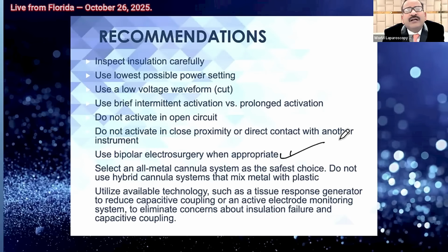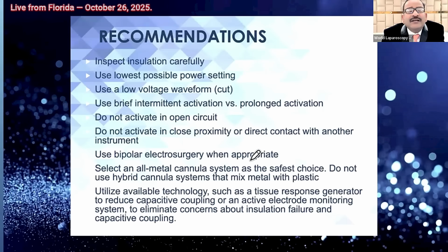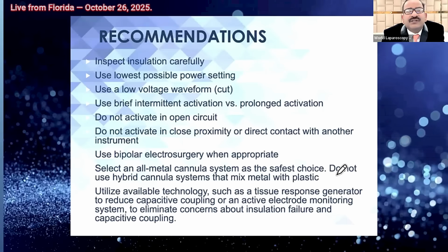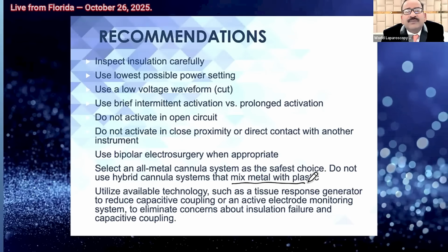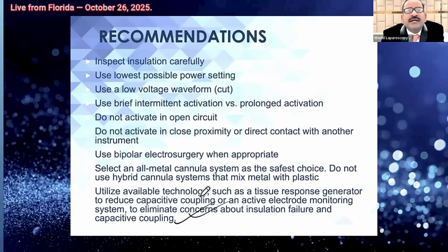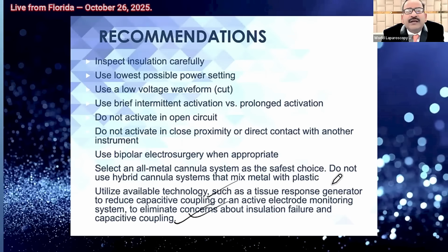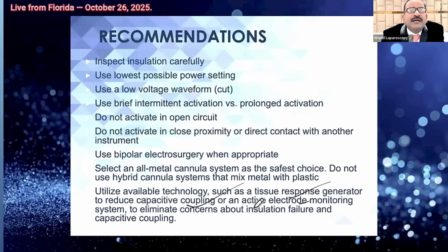Use bipolar whenever appropriate, because bipolar doesn't have remote injury. Select an all metal cannula system as the safest choice. Do not mix a hybrid cannula system which mixes metal with plastic. Why? To prevent capacitive coupling. And if you can, utilize the available technologies such as tissue response generator or AEM technology.